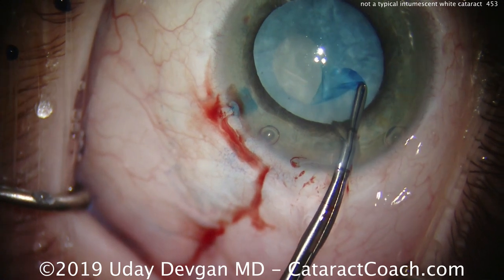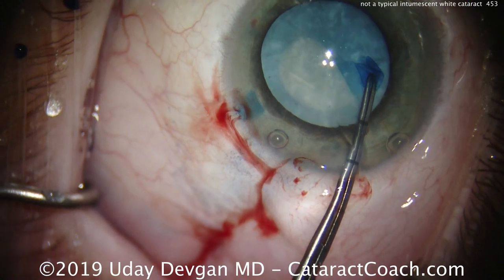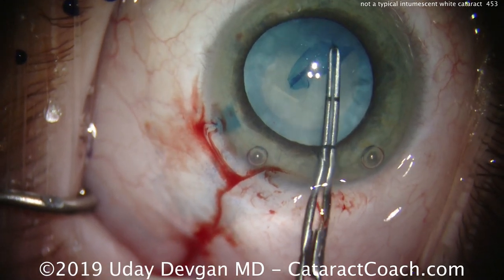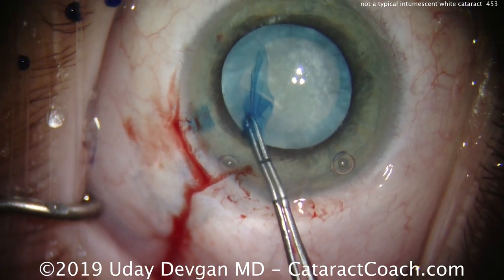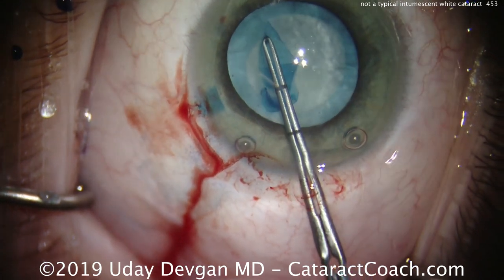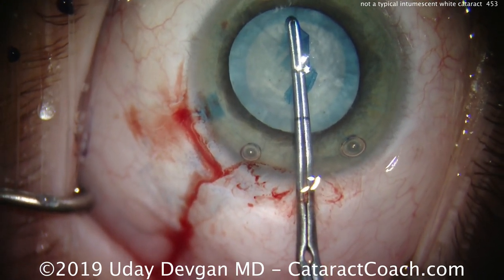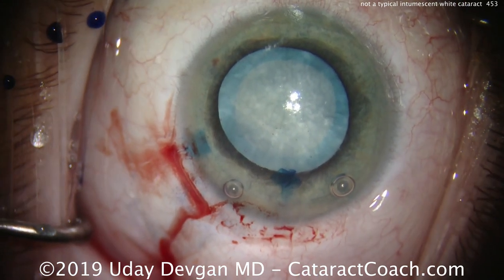We'll complete our capsulorrhexis now. A hint here: we definitely want to have an intact, round, and centered five millimeter capsulorrhexis — it's a very important part of this case in order to have secure IOL positioning. Watch carefully finishing the rhexis, and then we'll measure it with the forceps. The first mark on my forceps is two and a half millimeters at the tip and the second mark is five millimeters. When we measure it — there it is — exactly five millimeters. That looks great.